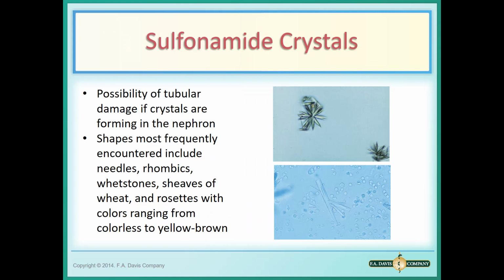Sulfonamide crystals are an iatrogenic one. So this is some kind of a sulfa drug, perhaps, sulfonamides. And these take on, again, this rosette formation. These are pretty large.